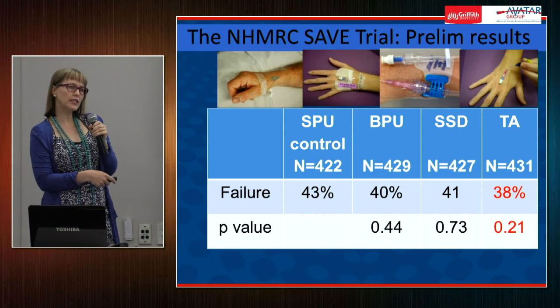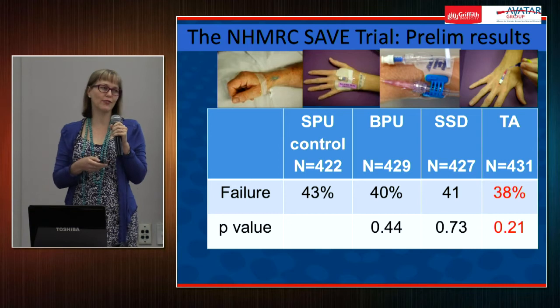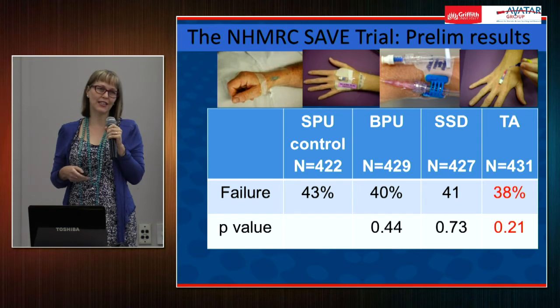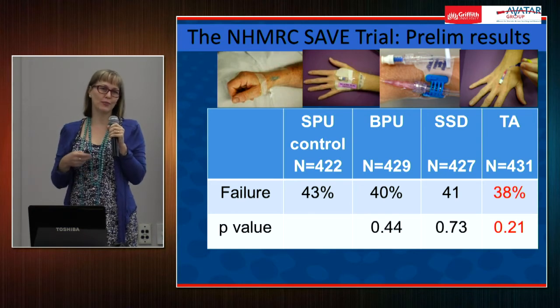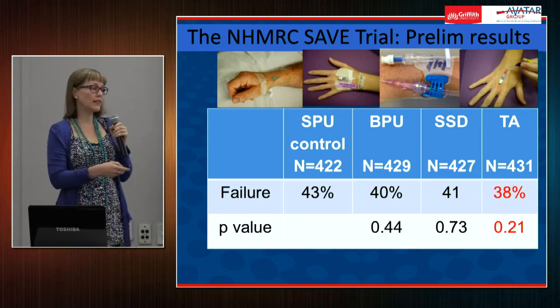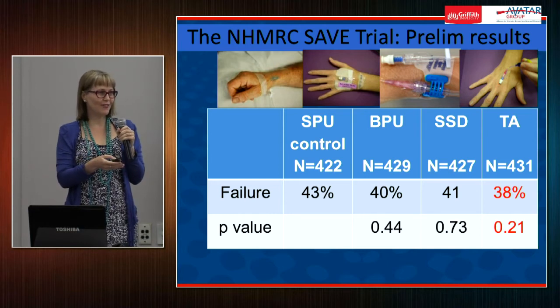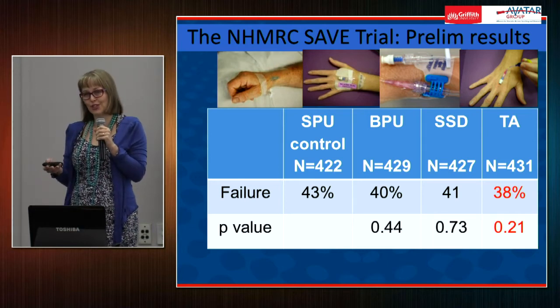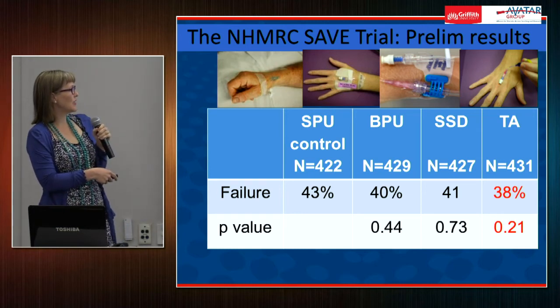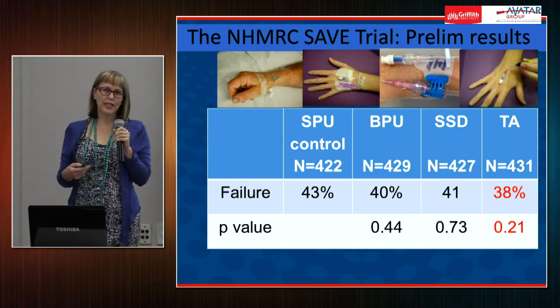So the interesting thing in this study, and maybe what caused those results, was that nurses didn't just put any one of those dressings on and leave it at that. They were very ingenious and added many, many layers of all sorts of tapes, tubey grips, backboards. There was heaps of added securement. So that's the real world. In research, you have to have this balance between testing things carefully, but also accepting that people are going to use them in the real world setting. So we didn't stop people doing things. And I think maybe that's why the groups ended up very similar, because of all this extra product that's used.